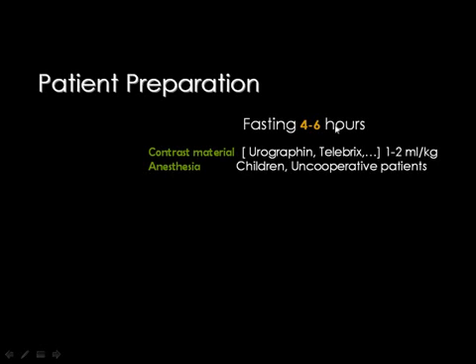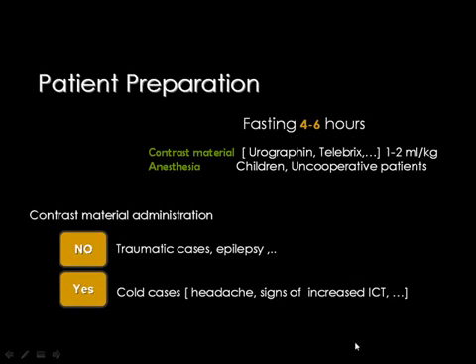This fasting is required whenever the patient is going to be injected with contrast material, or will receive some kind of anesthesia. We usually inject the patient with contrast whenever we are looking for intracranial infection and brain tumors. But there is no need for contrast material in cases of trauma and cerebrovascular stroke.